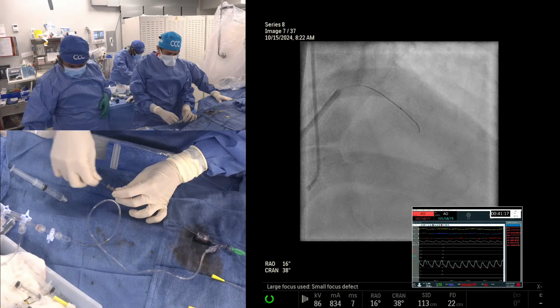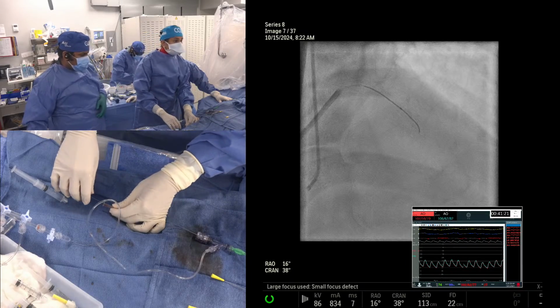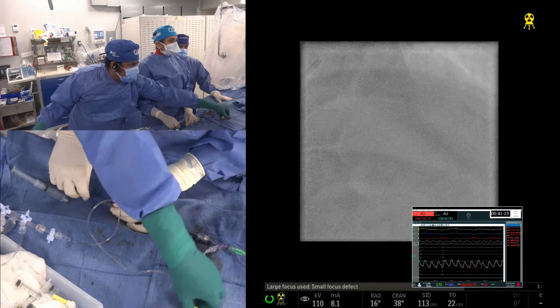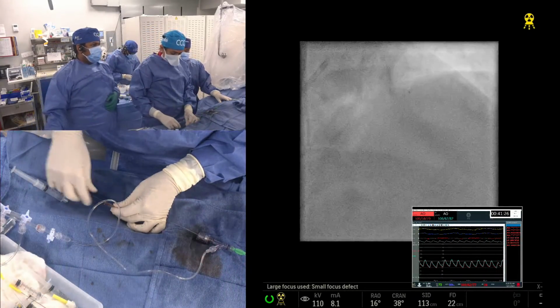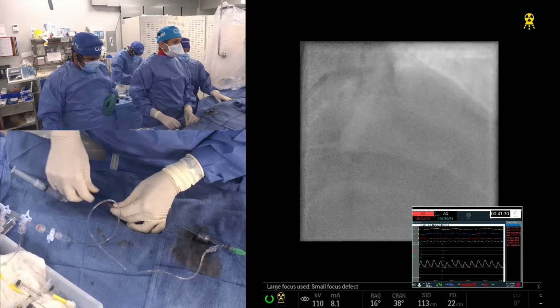So now this one is Miracle. So you have Miracle 3-6. I took the 6, or you want to go to Gaia 2-3. Any one of them is okay. Gaia has come with a pre-shaped curve. The good thing about Gaia is that it is a hydrophilic tip also. All these tips have hydrophilic coating.